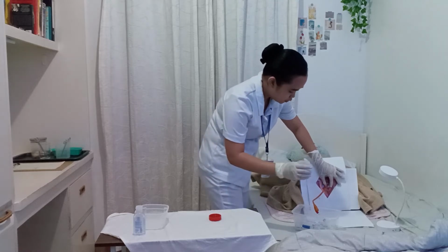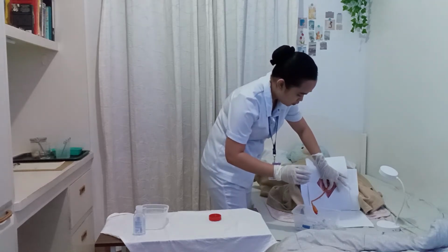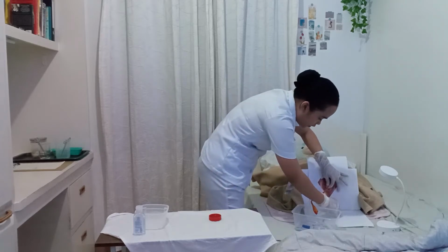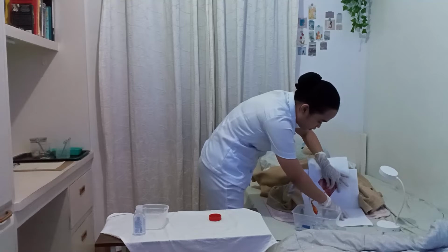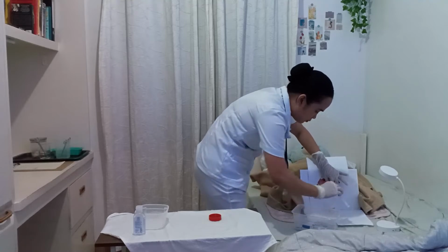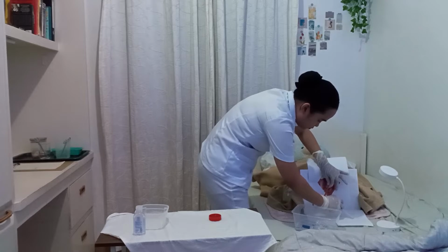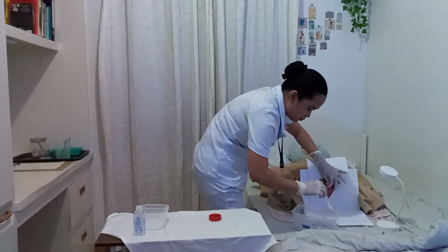Okay, and I'm going to pinch the catheter using my unsterile hand. And I'm going to place it right here. Okay, and that's it.